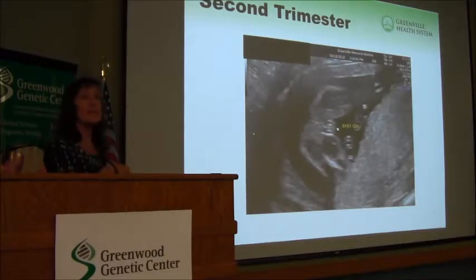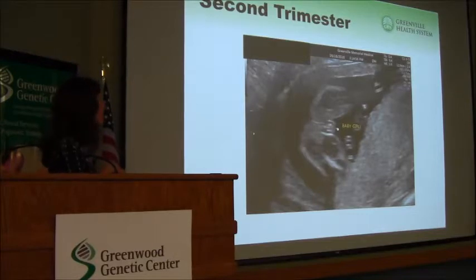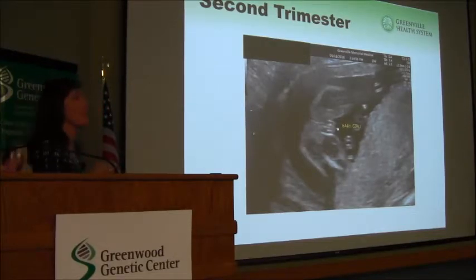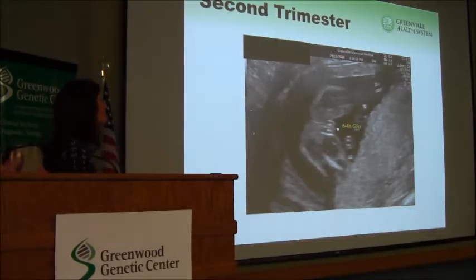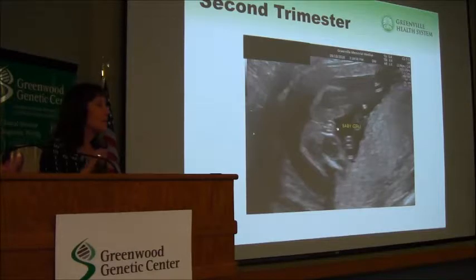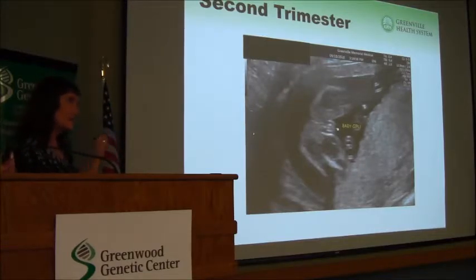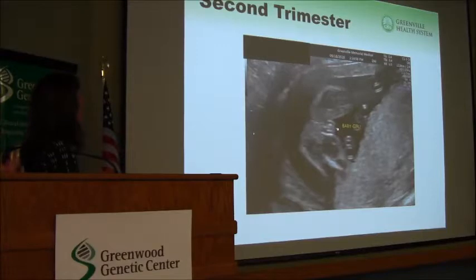Okay, this is why parents come to our office. They want to know what they're having. Now, you guys have helped with the cell-free DNA. They're finding that out much earlier. We just confirm it. But certainly in terms of looking at birth defects, every once in a while we'll see a hypospadias. That is not very common to see on ultrasound unless we turn on color flow and catch the baby urinating and see that it's not coming out of the tip of the penis.